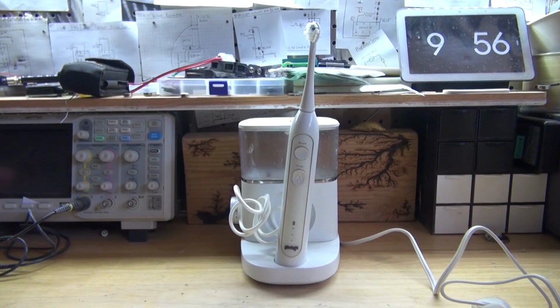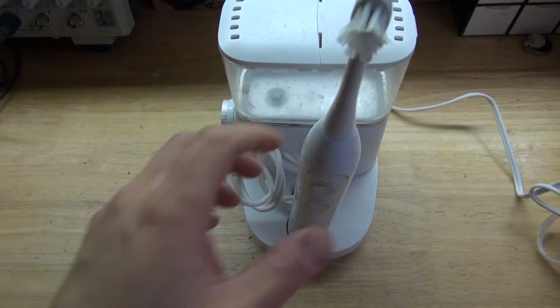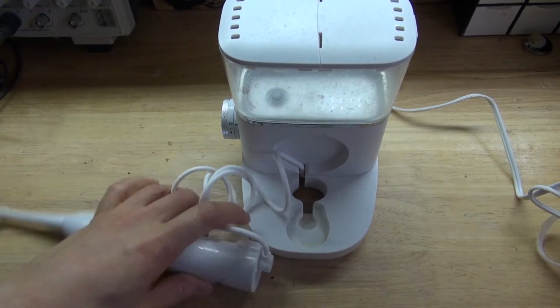In this video, I want to do a teardown of this water jet toothbrush. I want to see how it works, and I want to see if there's any parts worth salvaging. Let's get started. First, what I want to do is examine this device. I want to see how this can be taken apart by looking at different parts of it.